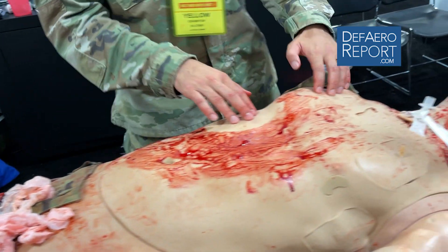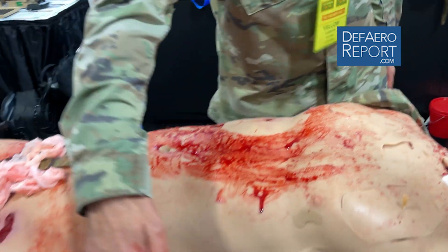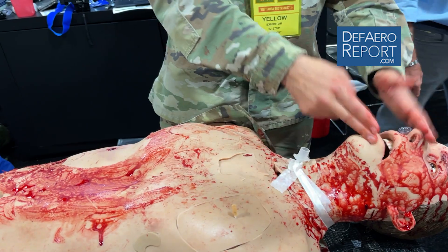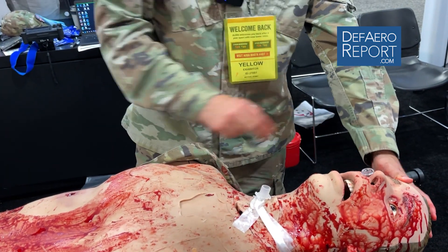The mannequin can breathe. The mannequin can bleed. We can administer IVs. We can administer IO access. We can do crikes. We can do intubation, nasal trumpet.